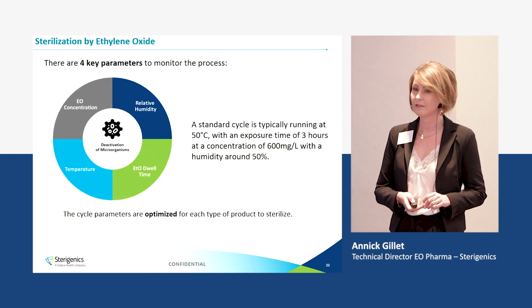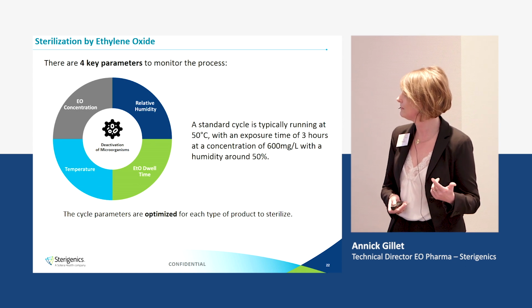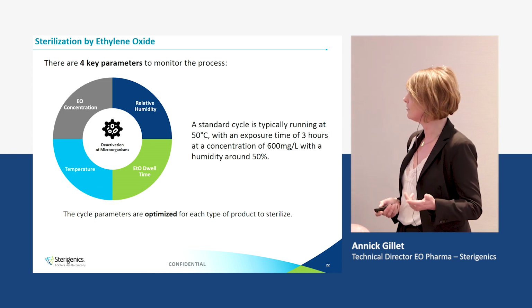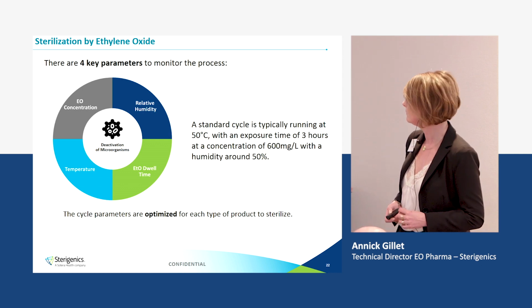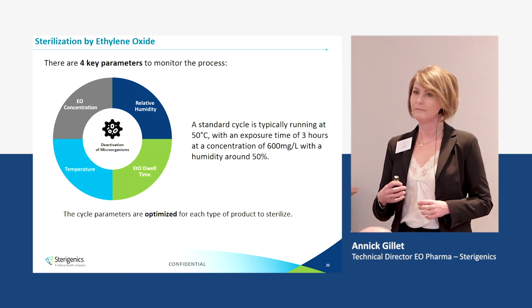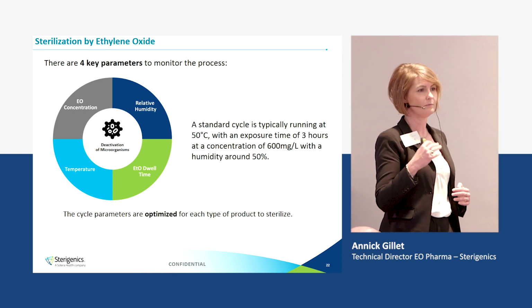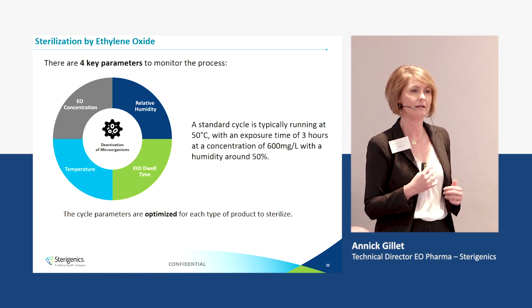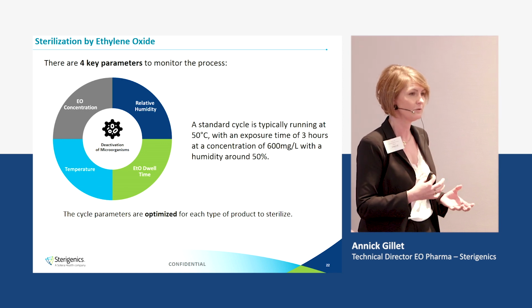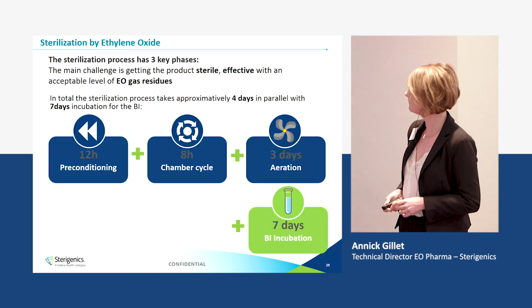For parameters to consider, I will not enter into the details, but humidity, exposure dwell time, temperature, and EO concentration are the main ones to consider. And it makes it quite complicated, but also flexible, because it means that when you have a high concentration, you can play with a lower exposure time, and the opposite is true also.